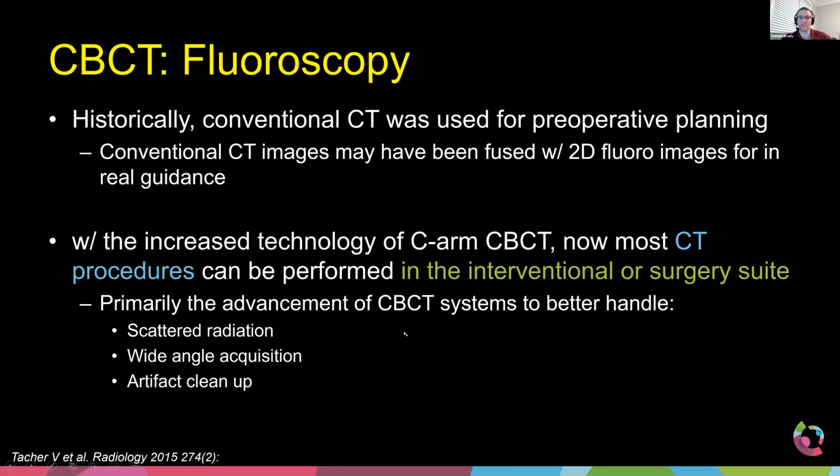They don't actually do a lot of CBCT in the room. That said, some will still do the traditional CT workup. They'll get the patient in the room, do a single CBCT, and then they'll fuse the two data sets again. Or they'll even fuse an MR set. And so they're really only using the CBCT scan as a way to fuse other data sets. So that's historically how we've done it.